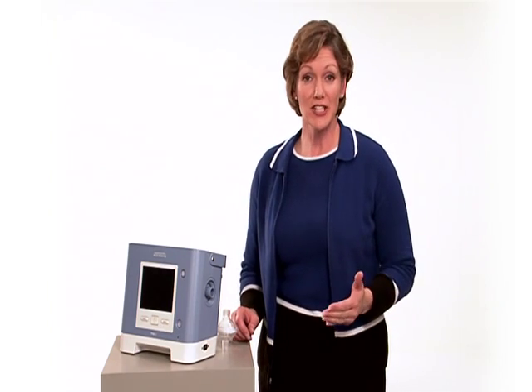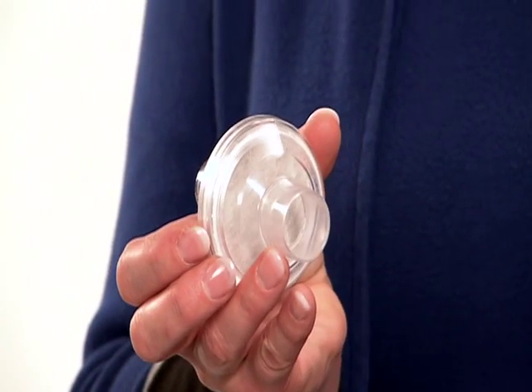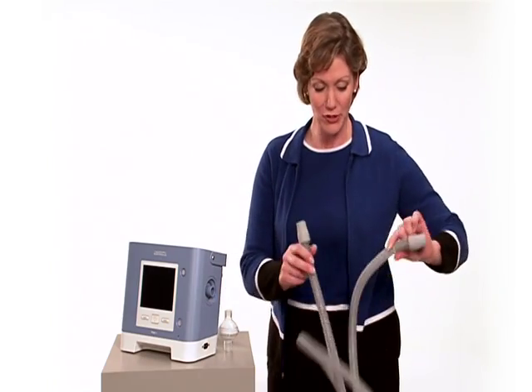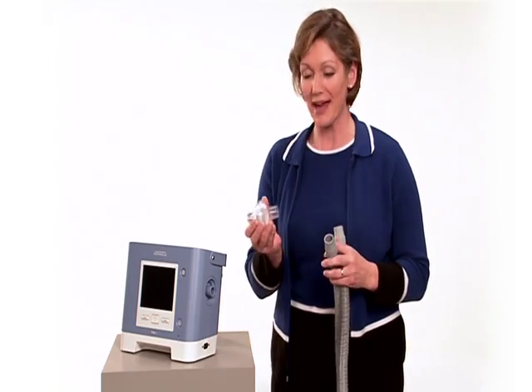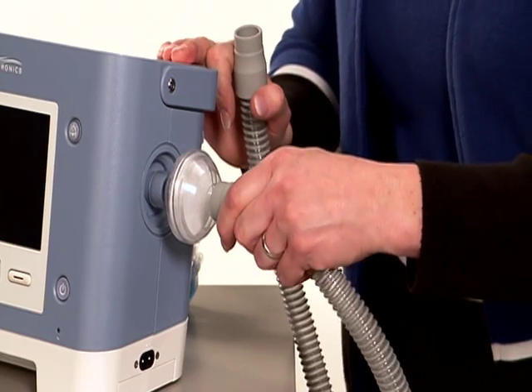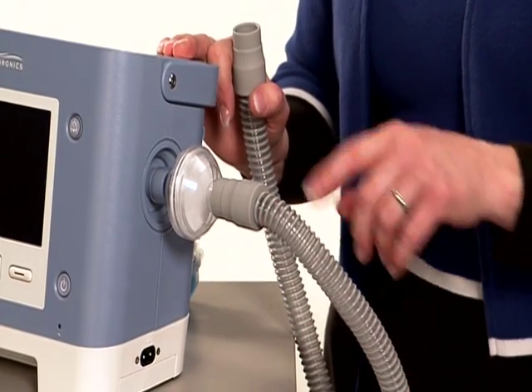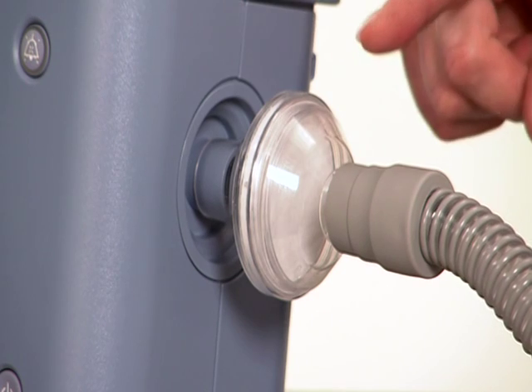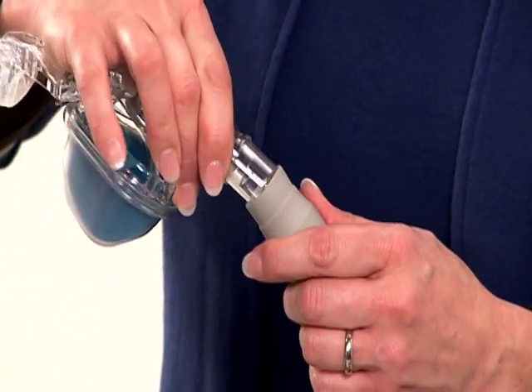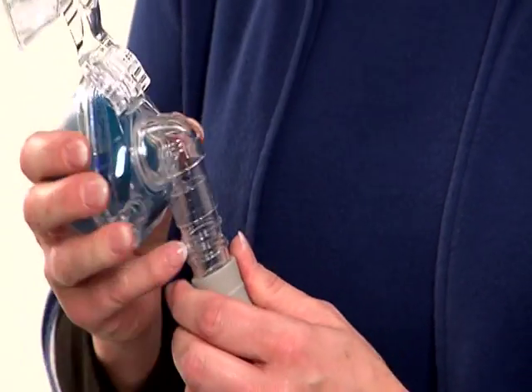The ventilator is designed to work with either a passive exhalation port or an active exhalation valve. An optional bacteria filter can be used with either type of valve. To set a passive circuit up, connect one end of the flexible tubing to the outlet of the optional bacteria filter. Insert the bacteria filter inlet to the breathing circuit connector on the side of the ventilator. If you aren't using the optional bacteria filter, attach the tubing directly to the breathing circuit connector. Connect the other end of the tubing to a mask with a built-in exhalation port.